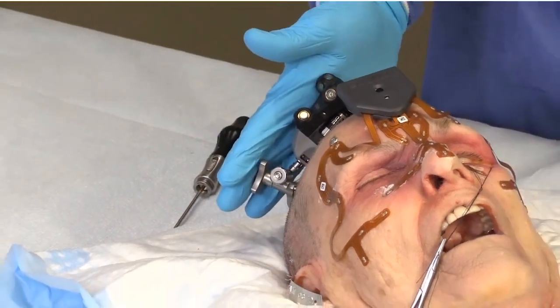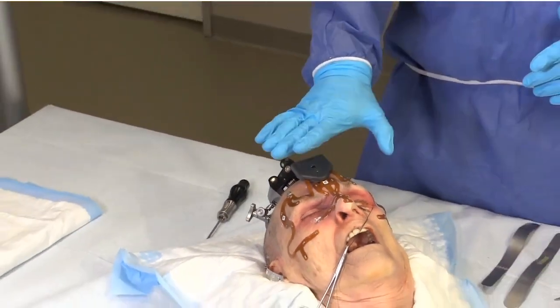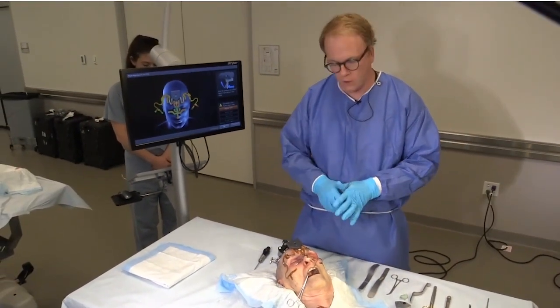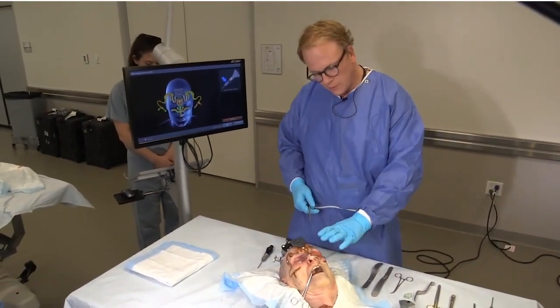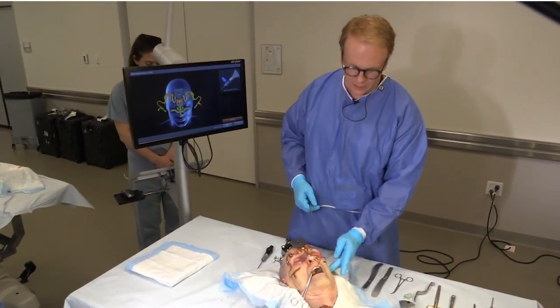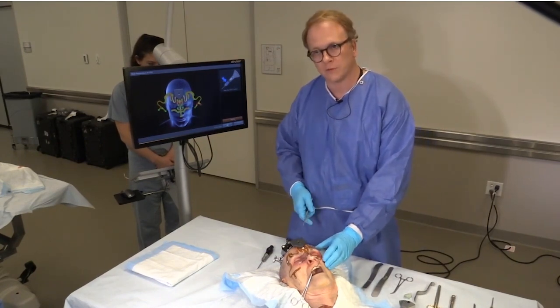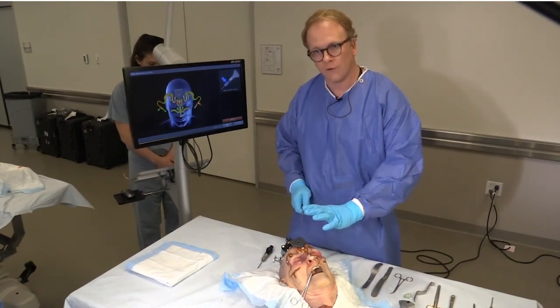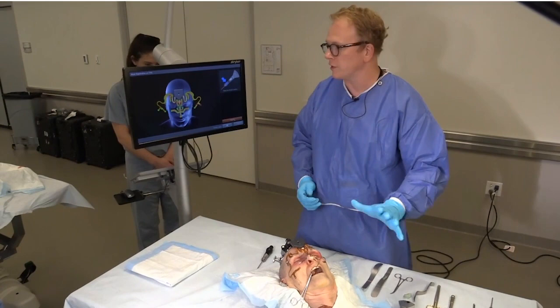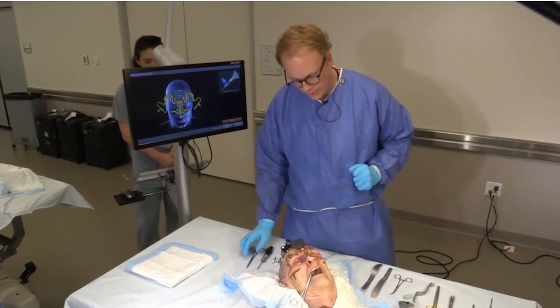It's one extra step and a little more unwieldy than just the mask. If you can get away with just the mask, it's really the way to go — it's more than adequate for a TMJ case, a zygoma osteotomy, zygoma fracture reduction, or almost any kind of orbit surgery including decompression, fractures, or deformity.